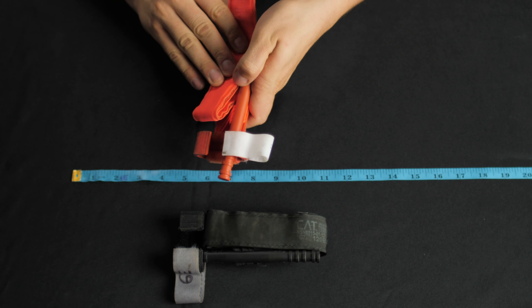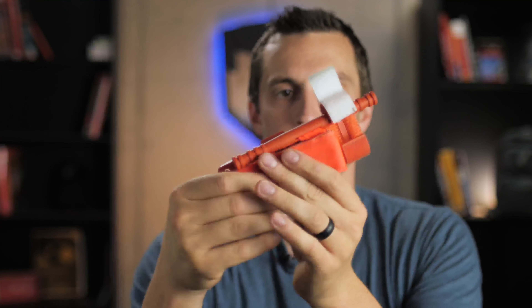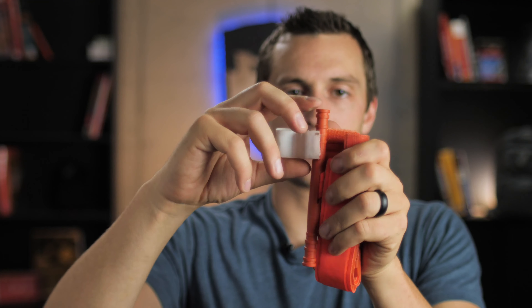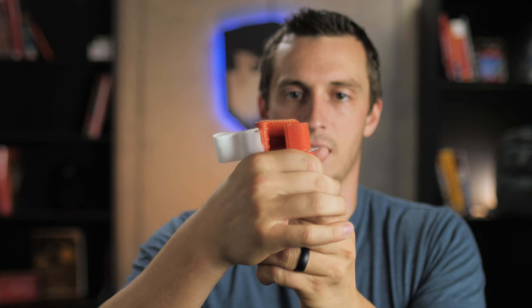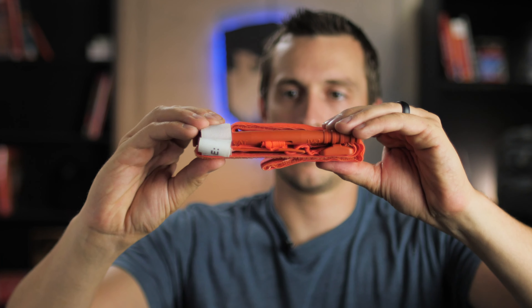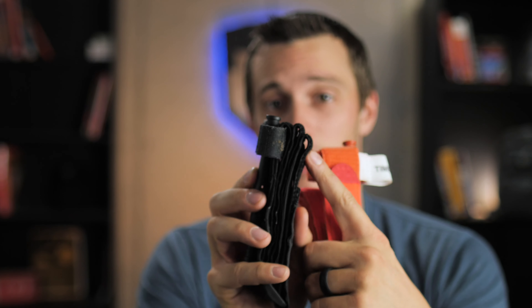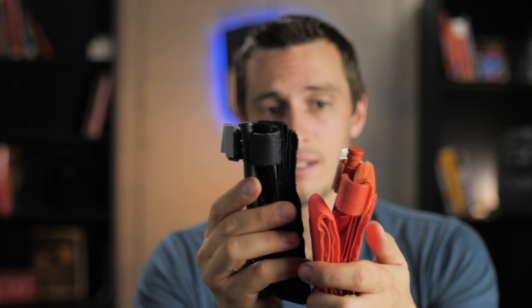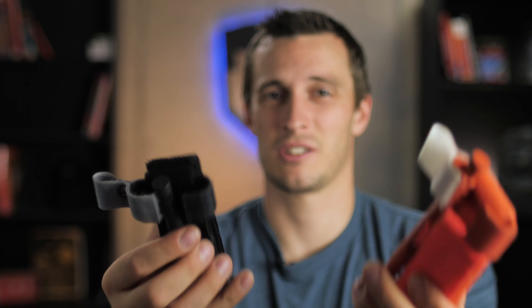We have most of the tourniquet now packed in the same thickness as this plastic clip, so it's not much thicker than that clip altogether. The windlass sticks up a little bit, but if you leave a little slack in it, you can shove it down so it fits in about the same area. Put it in a tourniquet holder or pouch and it's going to be a lot thinner. Comparing the two, you can see one is folded behind the plastic clip — adding to its thickness — while this one is folded up underneath it, taking some of that bulk away. Just a way to slim down the tourniquet and make it easier to conceal, especially in an ankle kit.